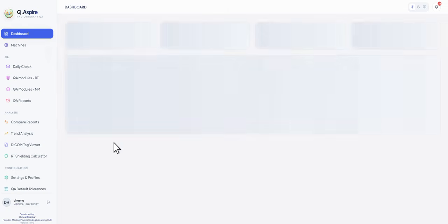Hopefully I'm waiting for more feedback, and once it is done, then I'll validate it and we'll release it so that any medical physicist can use it.